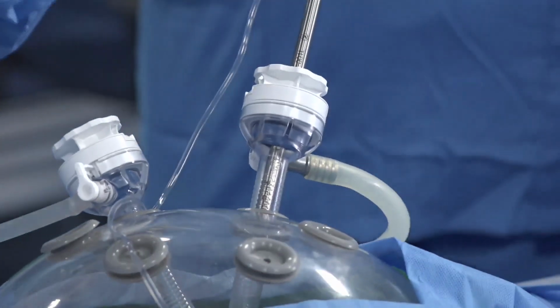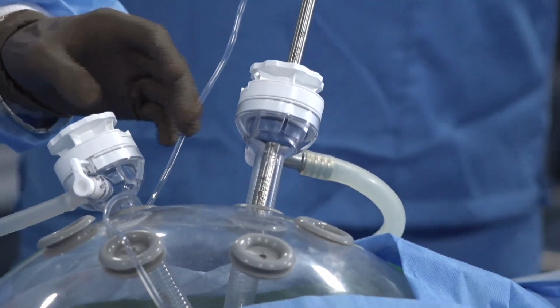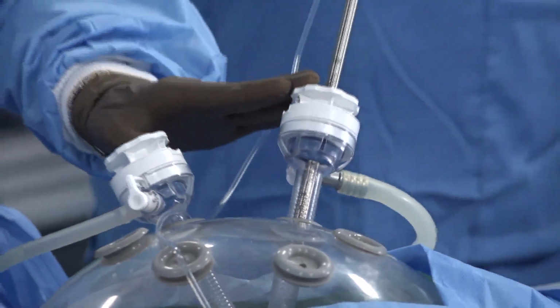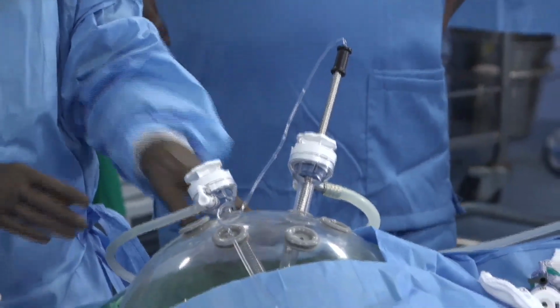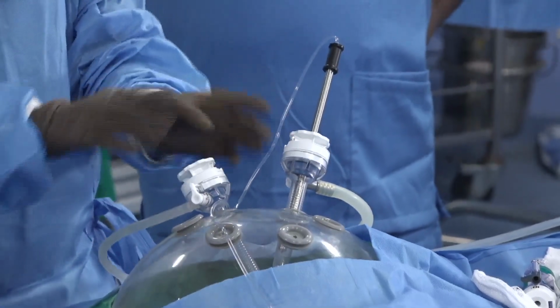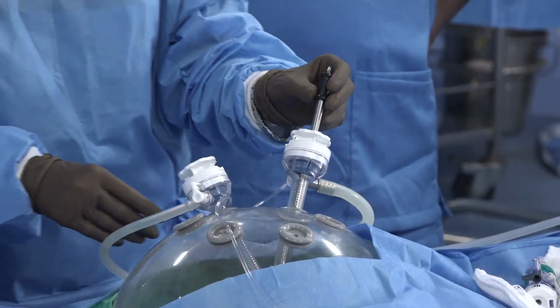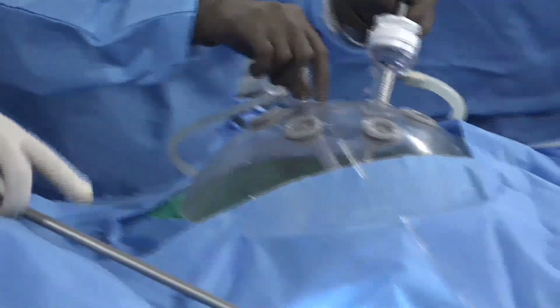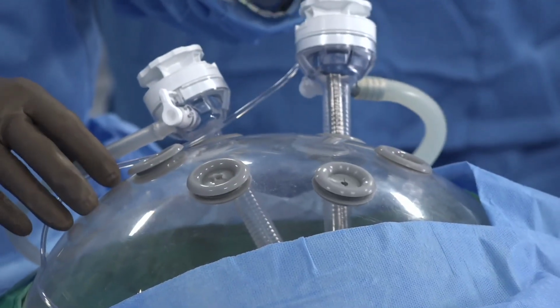Generally where to place these ports is also a big question, because in advanced cancers the abdomen has serious adhesions. So it is advisable to keep the capno pen port in the lower quadrant, or whichever, after you establish a pneumoperitoneum and put in a camera port, you have to tailor it accordingly. And as you can see, where to put the scope, can you show inside this? This port should be freely floating in the abdomen. It should not be touching any bowel.